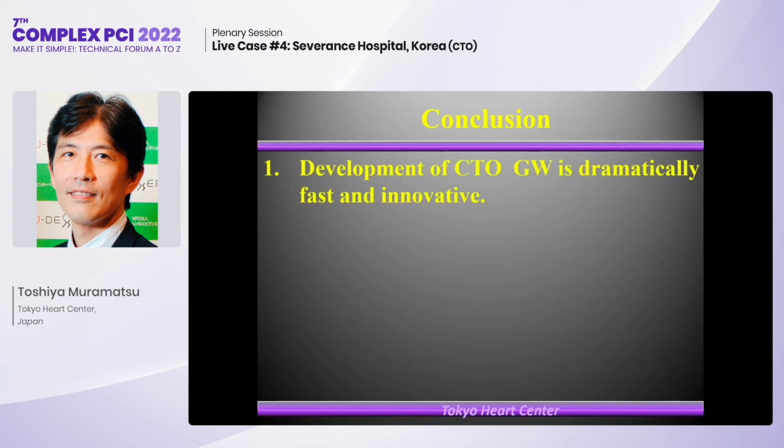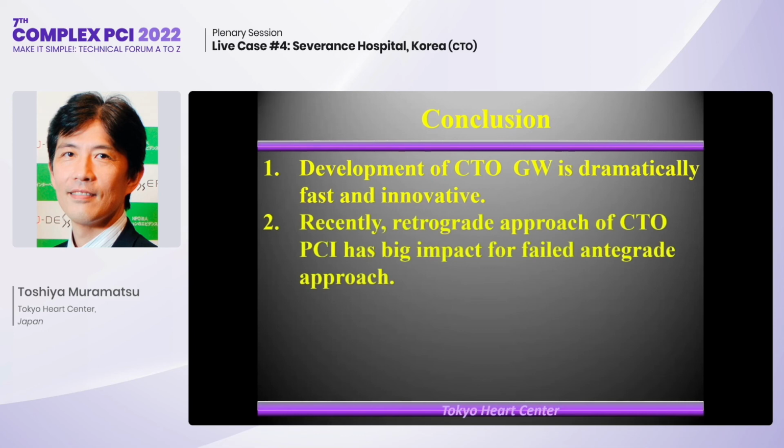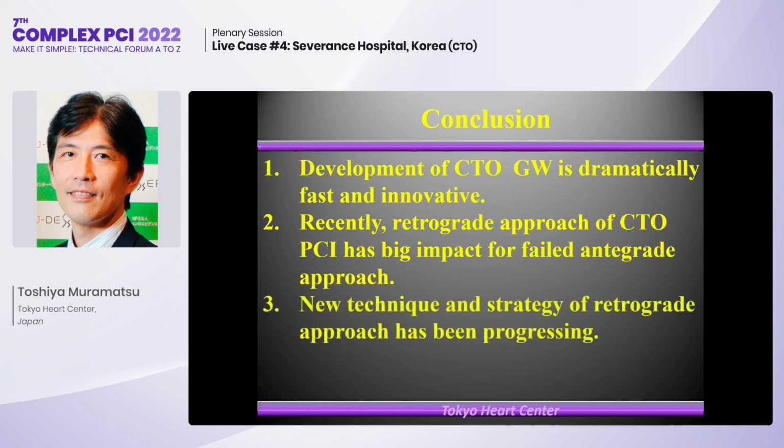The conclusions. The development of the CTO guidewire is dramatic and innovative. Recently, the retrograde wire approach for CTO has had a big impact on failed antegrade approaches. New techniques and strategies have been progressing, and CTO PCI has expanded worldwide.